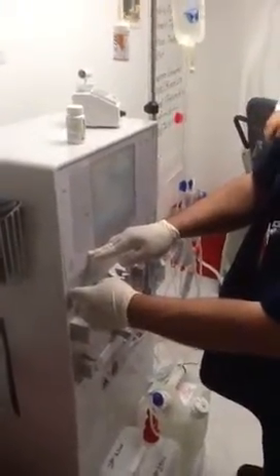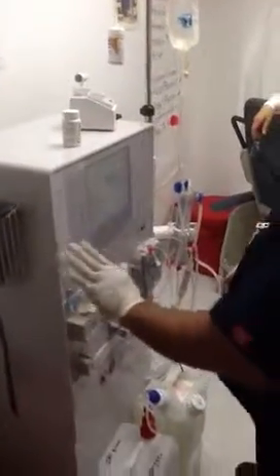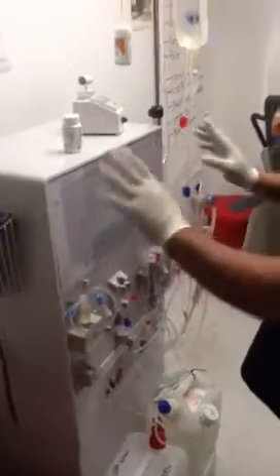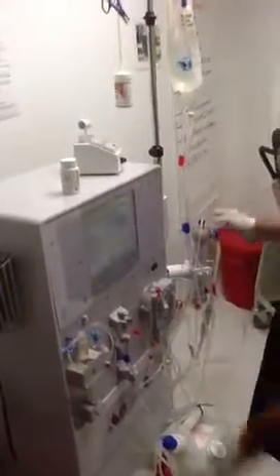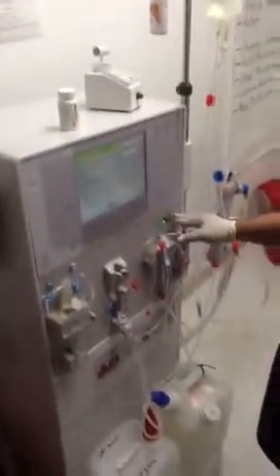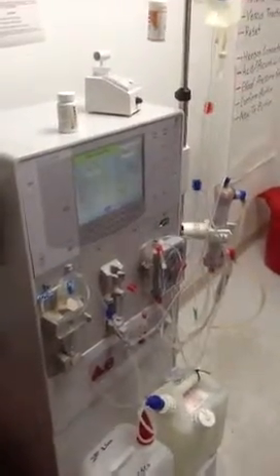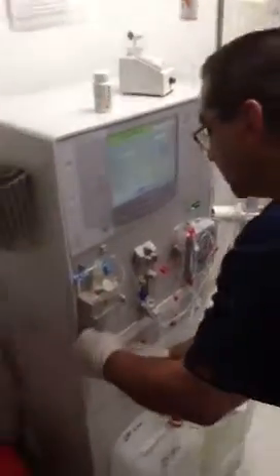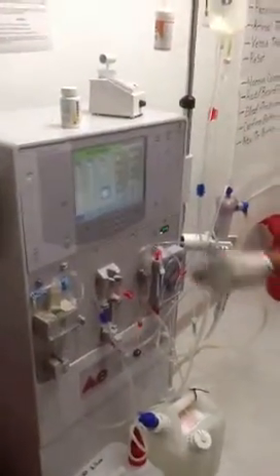Now we can connect the dialyser — blue to blue, red to red. Once both tests are done and you connect this, do: one — primary circ; two — confirm; three — start. Go at least 300 to 400, around 345. Now you're recirculating. Arm your air detector, go to the home screen, and you're done.